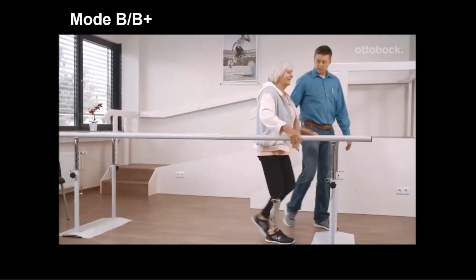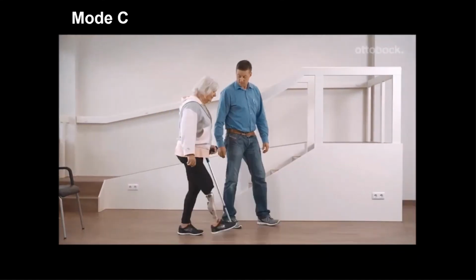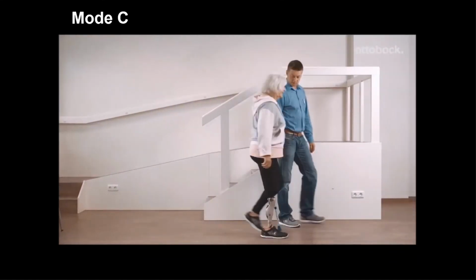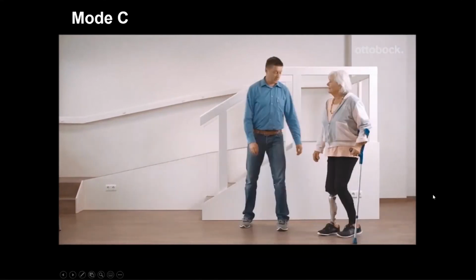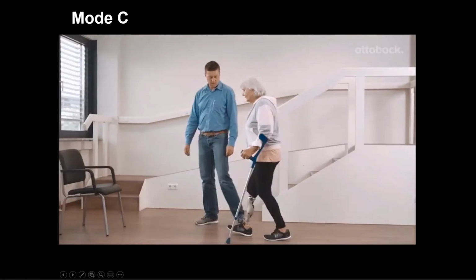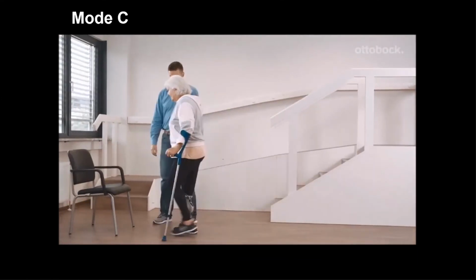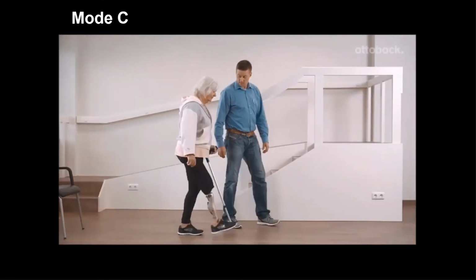Next slide, Dr. Kannenberg. And then mode C, as that individual begins to progress in their rehab and get more confident in using the knee, this is where you really have to make the determination, do you need a Kenevo for this individual or a C-leg? So Dr. Kannenberg laid out nicely the individuals that are transitioning down from a C-leg.